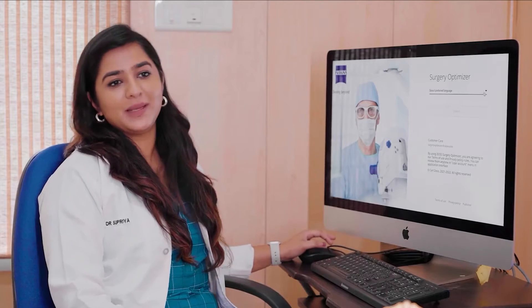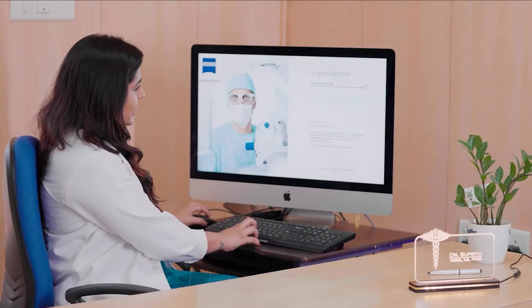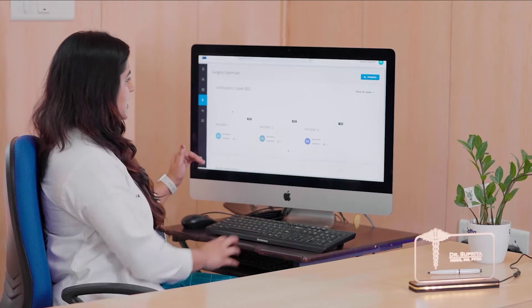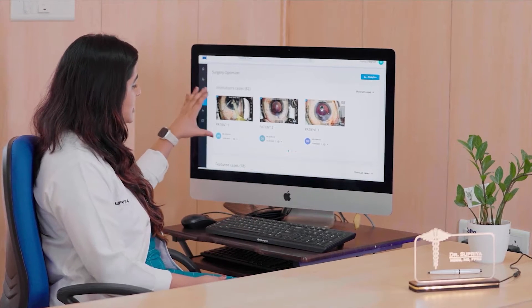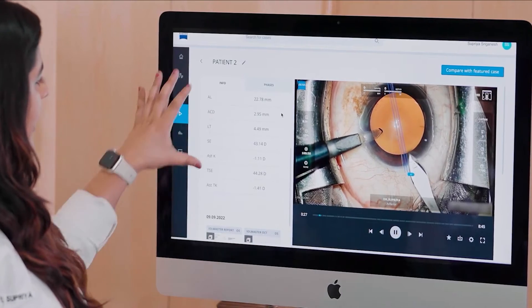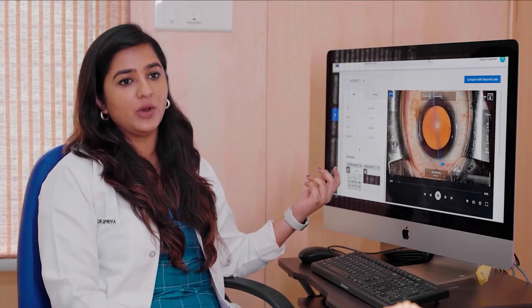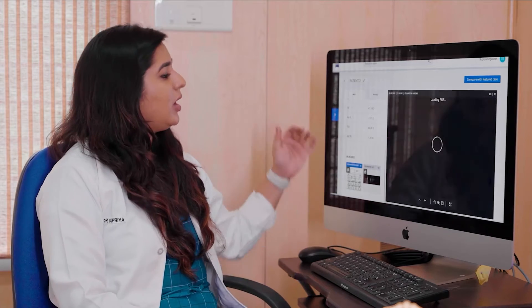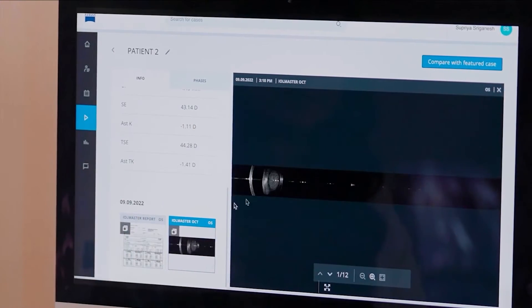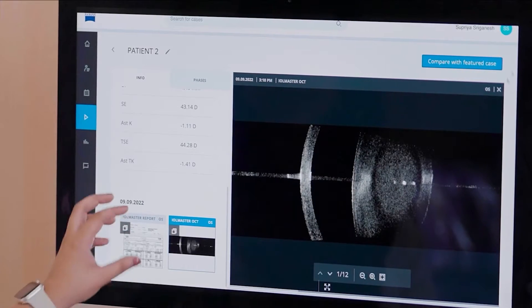This is what the desktop application of the ZEISS Surgery Optimizer looks like. After logging in, you see all of the institution's cases. On the left-hand side, you get all of the pre-operative information of the patient — all the scans that have been done. The biometry is easily visible and available, as is the IOL Master OCT.